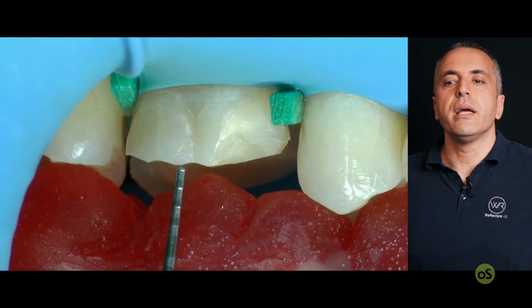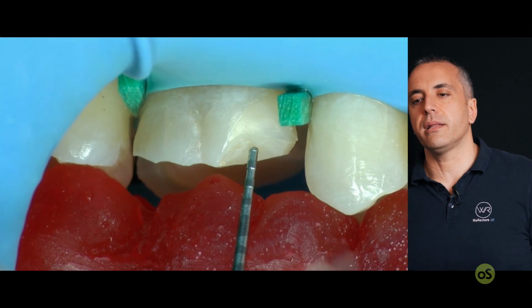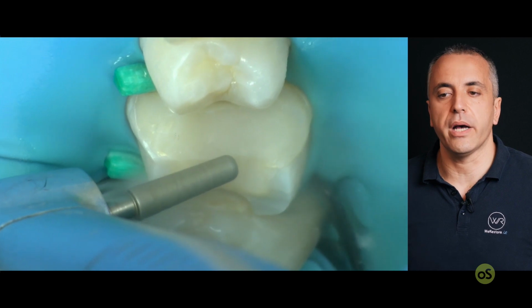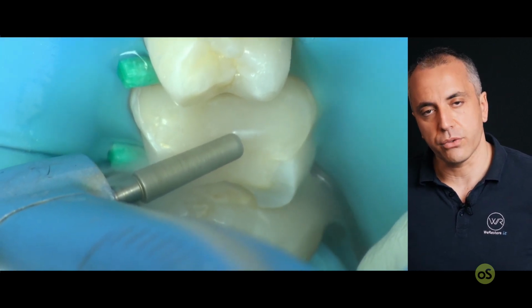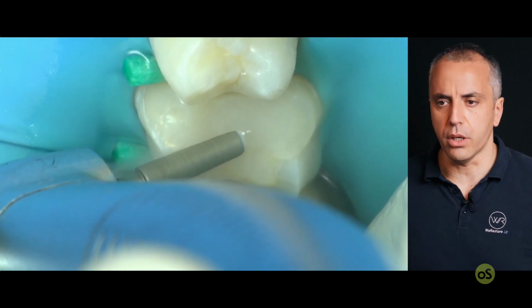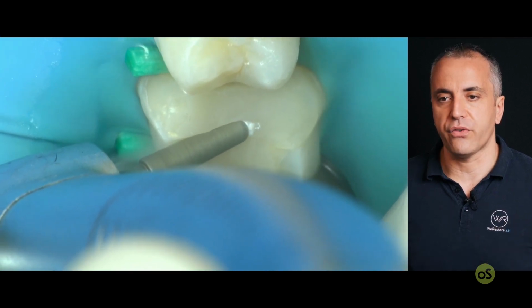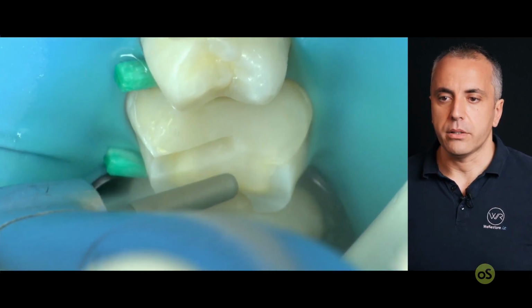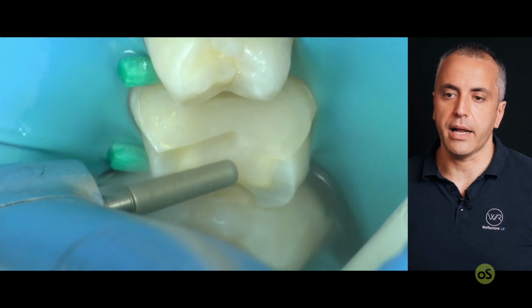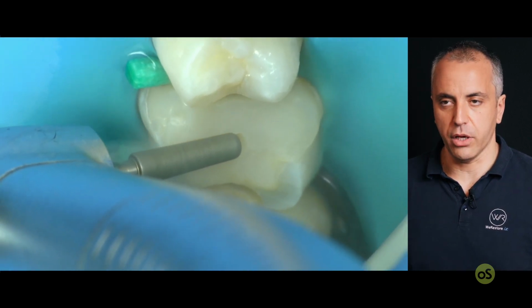Look at this. This is the occlusal key that we are checking. We have a nice distance on the distal side. We have a nice distance mesially. There is not good at all instead in the center part. So that's why I moved back to the burr that I used for the occlusal reduction, and I used it to provide the correct thickness of the future indirect restoration. So this is another notch that I created. This is another depression, and then I connect with the other part of the restoration.